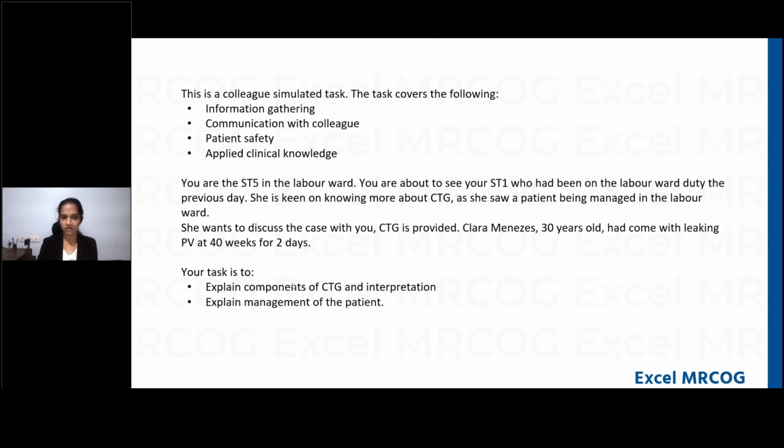So you need to understand that a patient is involved here. And I tried giving you clues and I said that the patient had meconium, right? So that means that is a clue you need to take. And then at least then you should realize that maybe there is more to the station. She is telling you that there is meconium. You should ask questions regarding the patient situation that would help you interpret the CTG, because as you repeatedly said, and it is repeatedly said in the NICE guidelines as well, you do not treat the CTG alone.